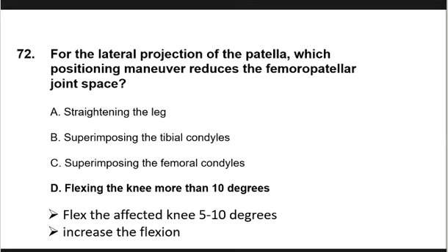Bakit hindi more than 10 degrees? In order to prevent, no? Para ma-prevent yung, that will cause fracture, no? More fracture of the patella. Kaya lang dito ang tanong to reduce, no? To reduce the femoropatellar joint space, yan, we have to flex the knee by more than 10 degrees.